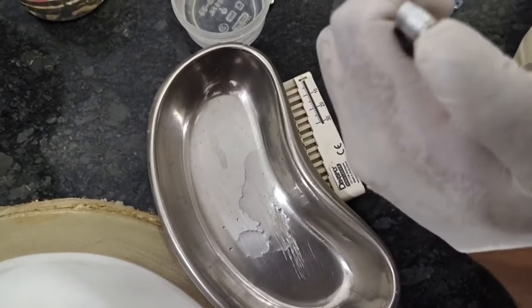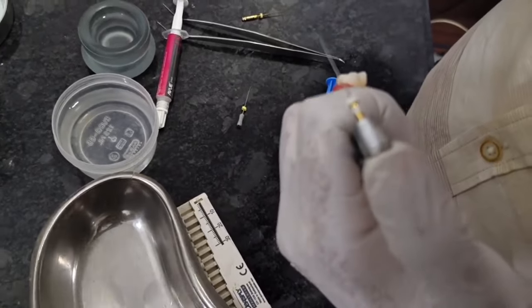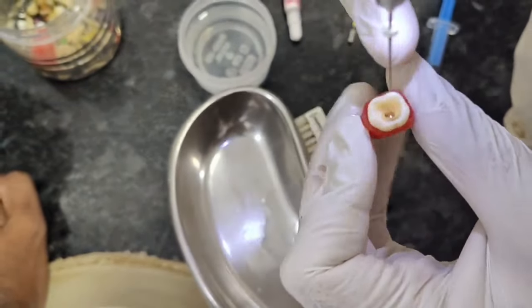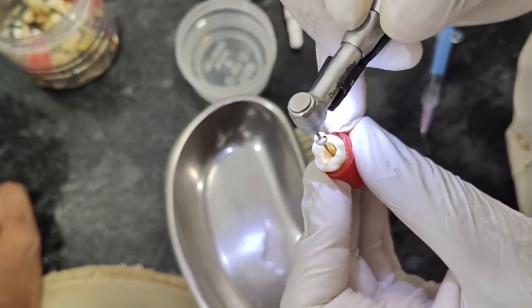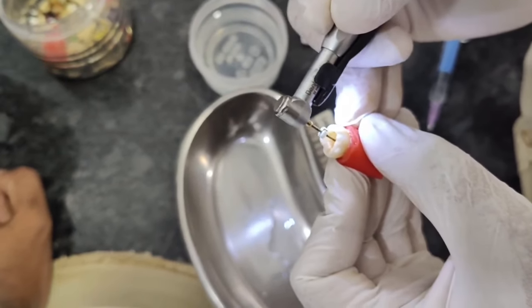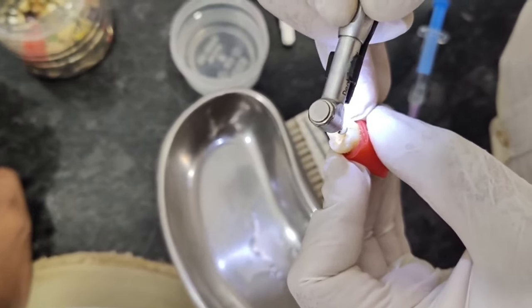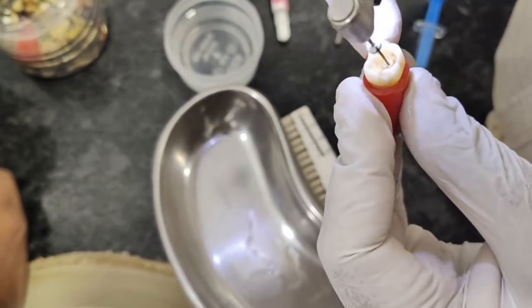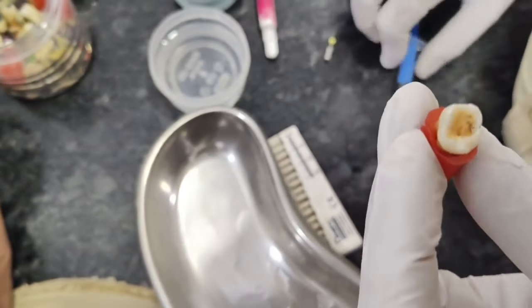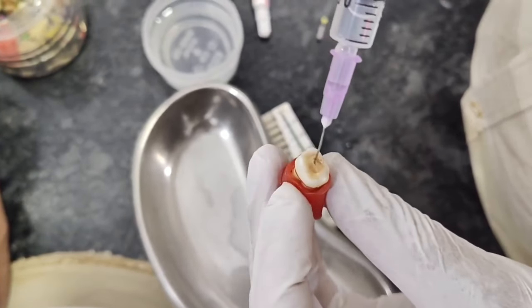After irrigation, we'll fix another file, which is the 4% 17 file. So after the path file, we are using the 4% 17 number file. You can see I have already irrigated all the three canals. You see it's going inside till the working length of the tooth. Then this goes into the mesiolingual canal. Then the mesiobuccal canal. The files, we should not re-enter again and again. Once we enter and take it out, that's all.